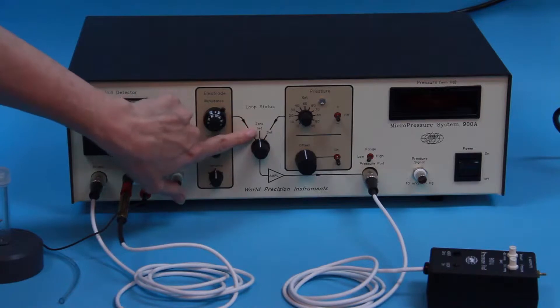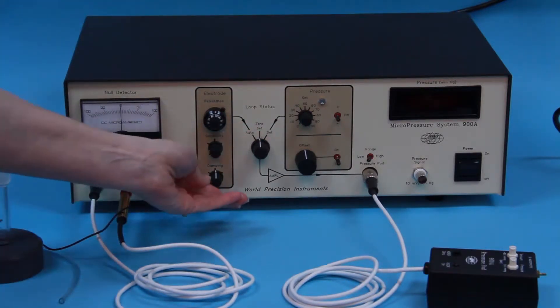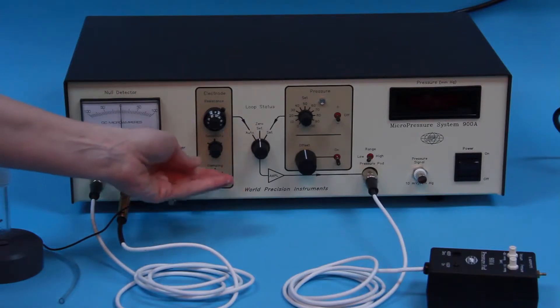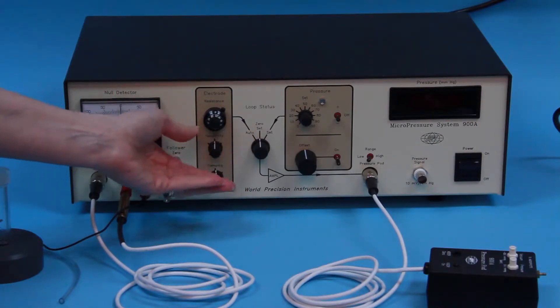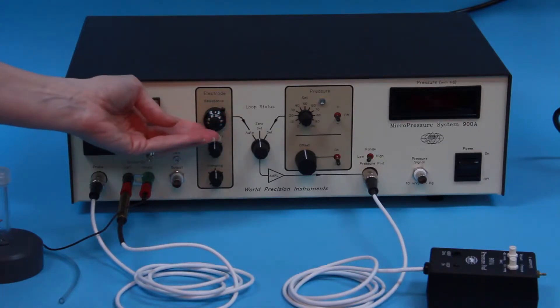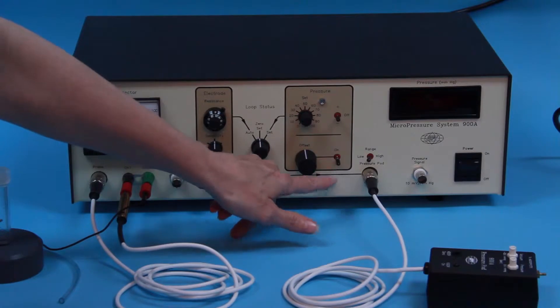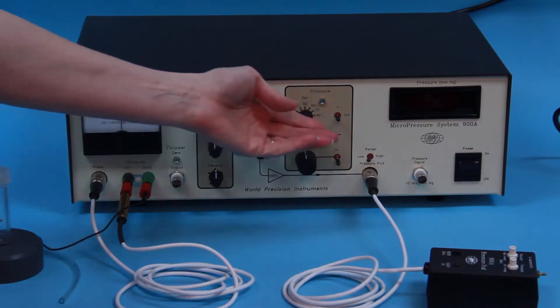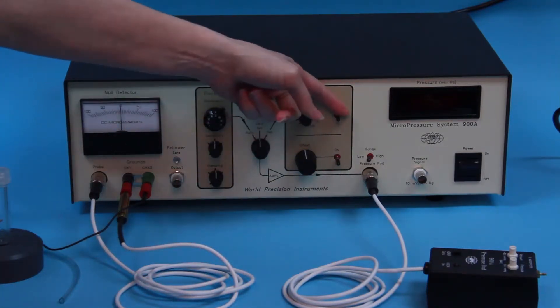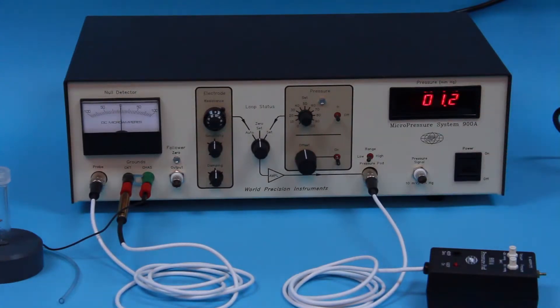This maintains a pressure of zero millimeters of mercury in the pressure chamber. Set the damping and sensitivity controls to the 12 o'clock position. Set the electrode resistance dial fully counterclockwise to zero. Set the offset switch to the off position. Set the pressure switch to off position. Then turn on the power and let the system warm up for 15 minutes.